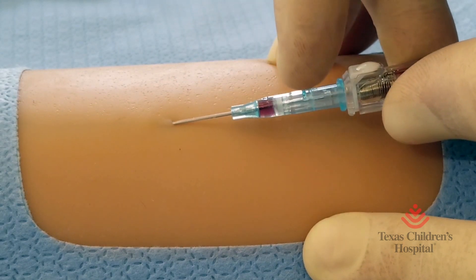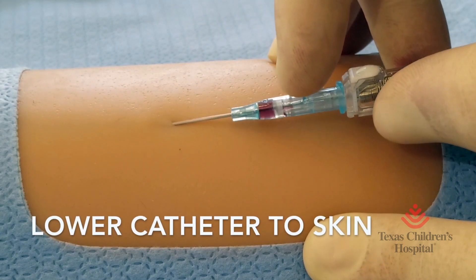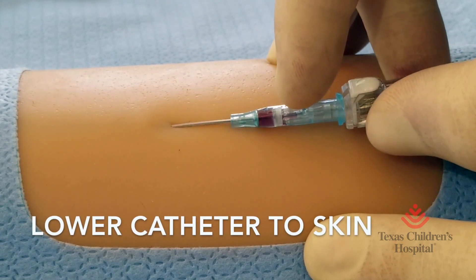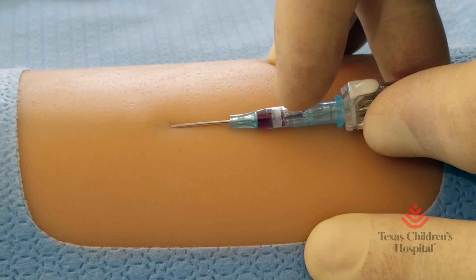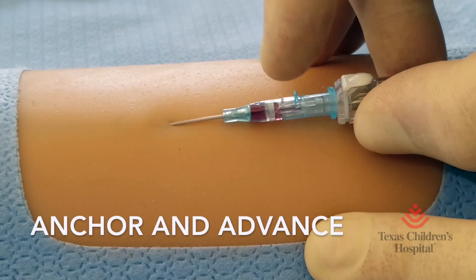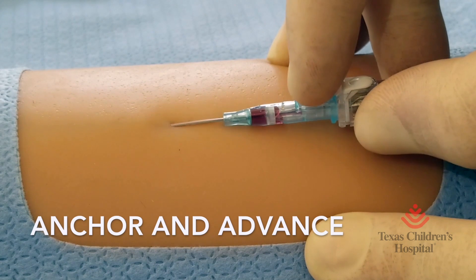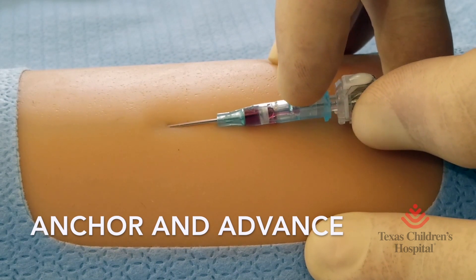Lower the catheter to the skin and anchor the device on the patient. With your finger, advance the catheter. The catheter should advance without resistance.